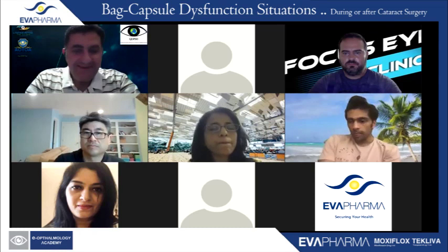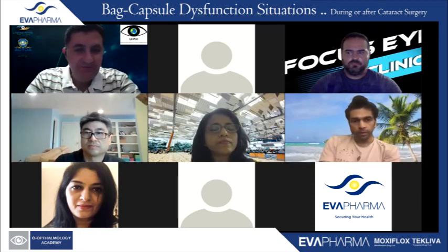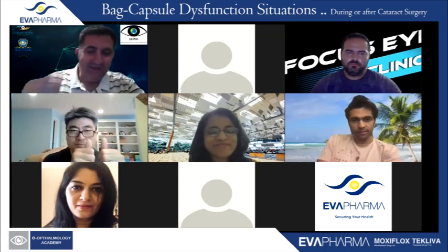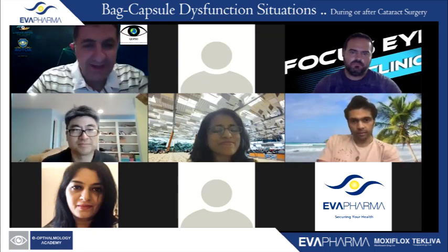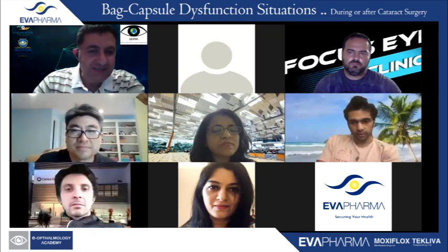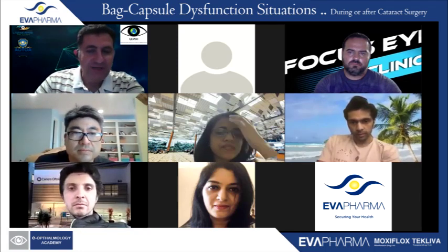Great, Susan. The technique is different, so different. But I'm going to ask you, because the same thinking, I noticed a lot of questions coming to you. Are you doing optic capture for these cases? Why didn't you do an optic capture?